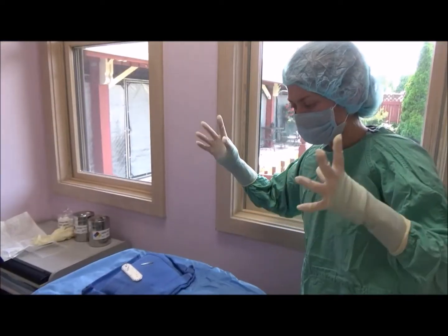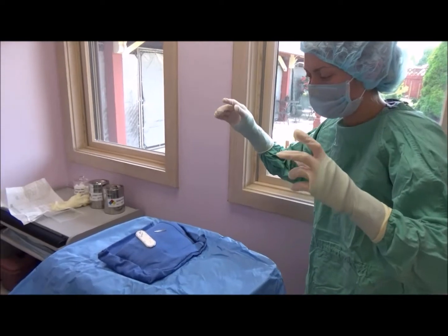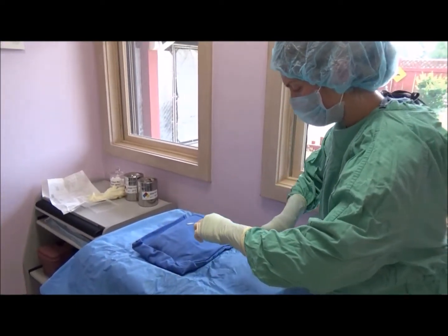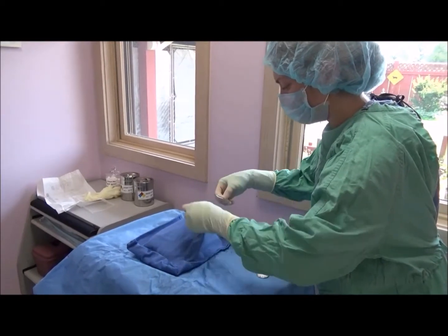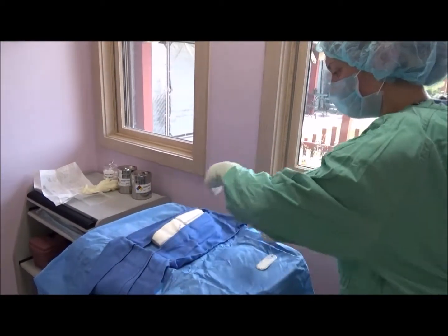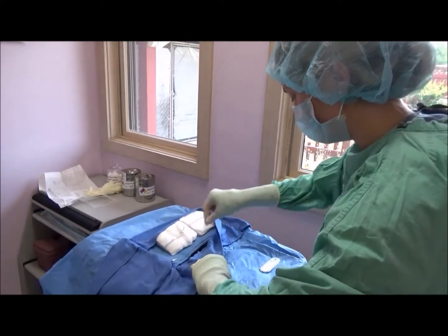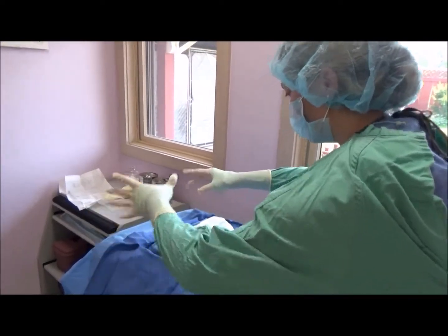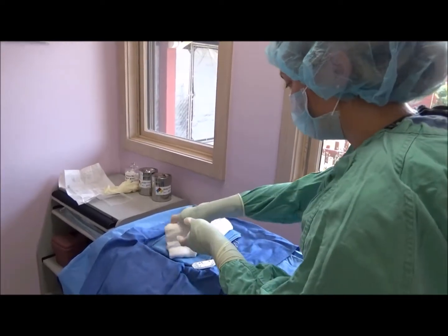Okay, I've already had a circulating nurse open the surgery pack here, so I'm going to organize everything in the pack. We have our sutures and our blade here. First I'm going to count the sponges.